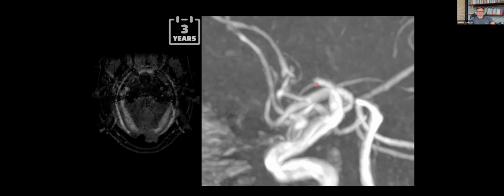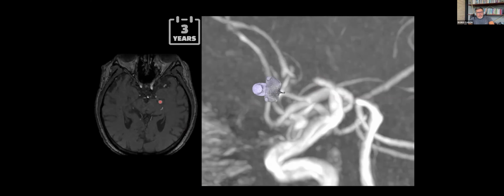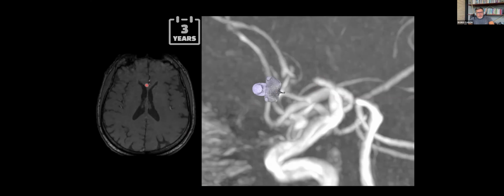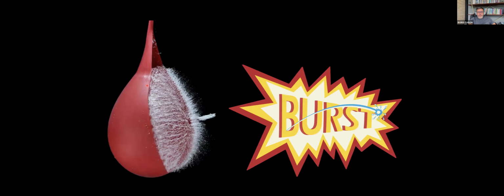This is the lateral view in the MRI. You may see here, and in the MIP, we can observe the aneurysm filling through the anterior cerebral arteries. This is a great case.